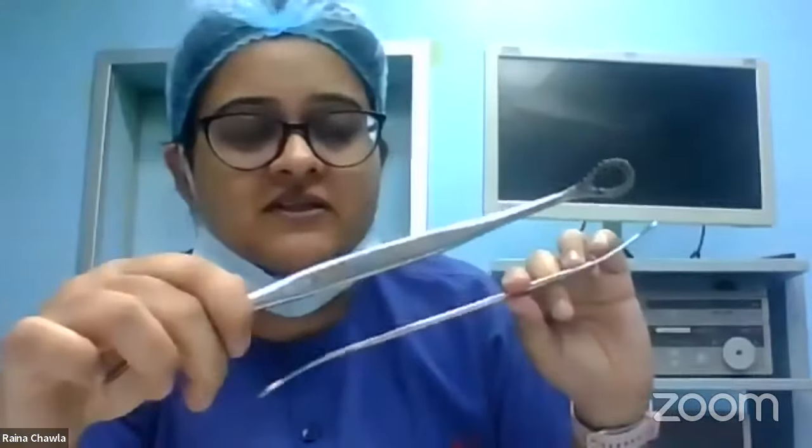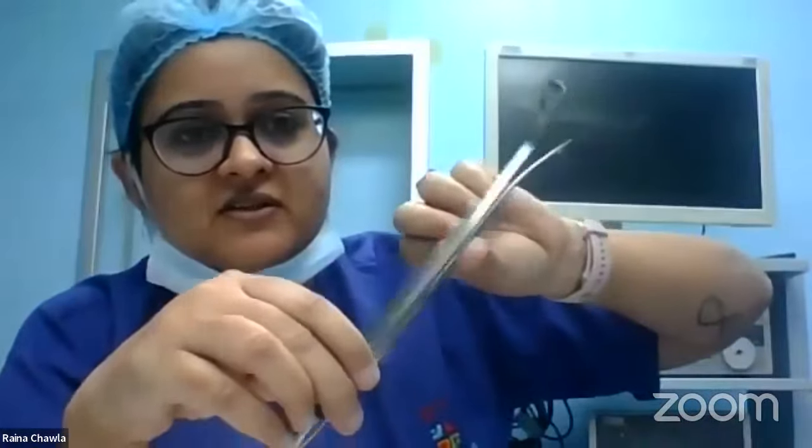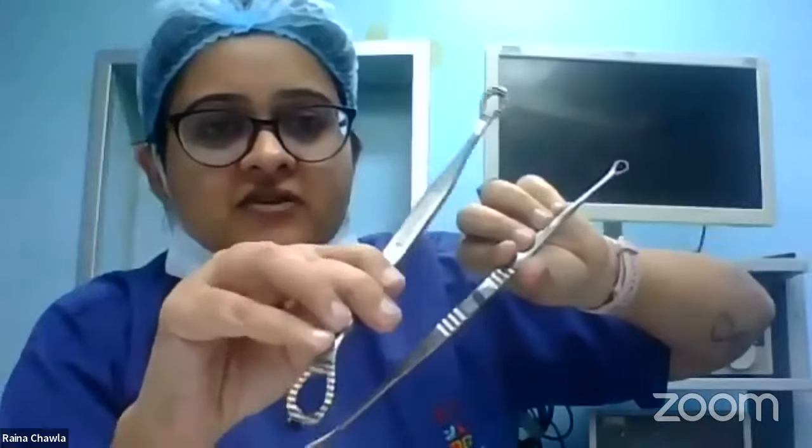Now, if you see a uterine curette, don't get it confused with this instrument. This is an anterior vaginal wall retractor. See how different it is. This is so big, and this is so small. It has huge ends, whereas a uterine curette has very small ends, and it has two ends.